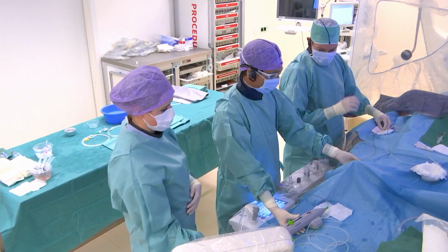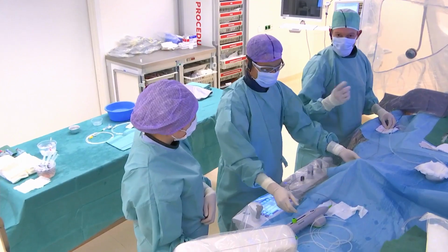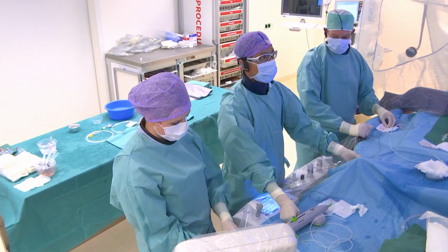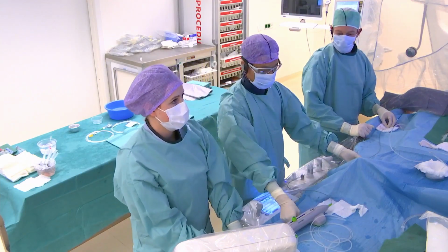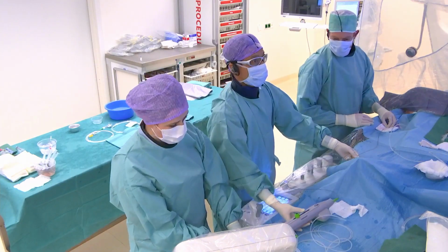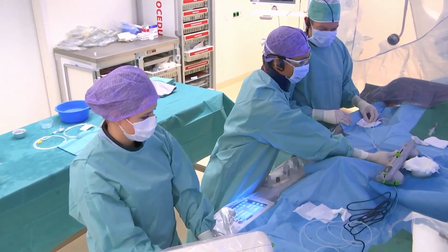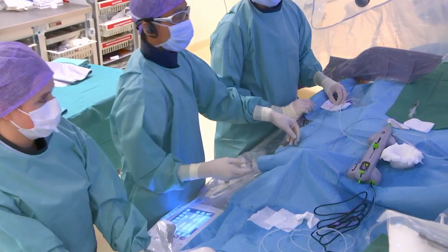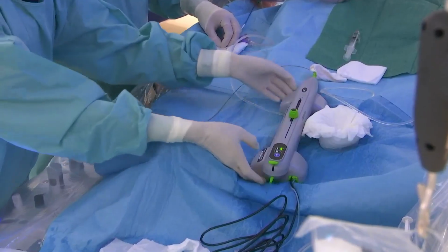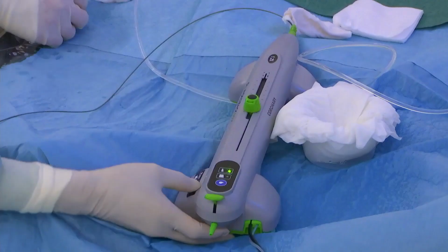Elaboration on this issue. What we would like to do, in order to keep the patient from waiting too long, so we have seen the case of Rich Lofnitz yesterday, which was obviously extremely fast, but given the novelty of the technology in Europe, we really wanted to spend a couple of minutes to demonstrate the device. For those of you, at least in the Western or European world, that are not that familiar with the device, Wijnand, can you briefly touch upon the basic features of this technology and how we prepare it? So here is the device itself, and the crown, you can see.